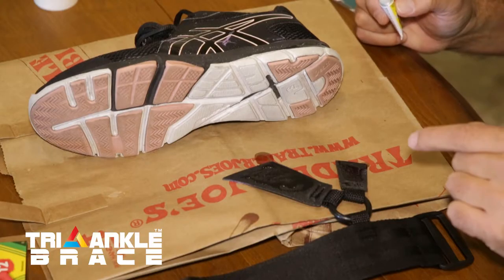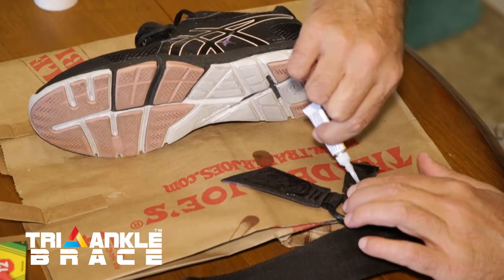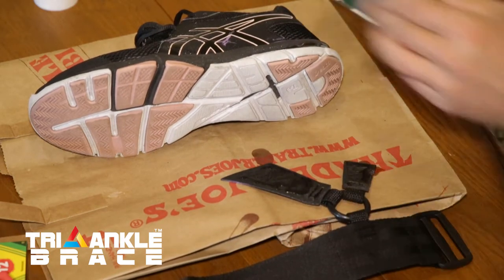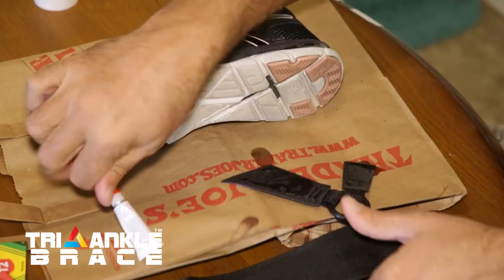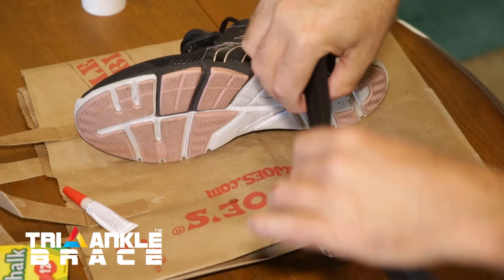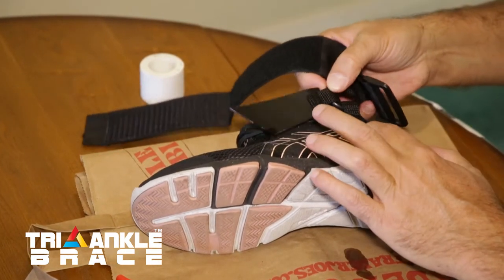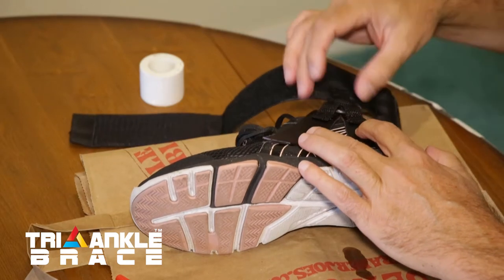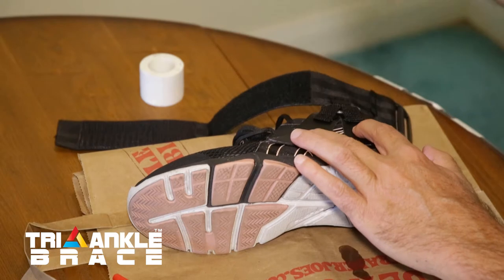Now that we have our shoes marked, we're going to put the glue on the unfinished side of the external pieces, making sure not to get any on our fingers. And then we are going to attach the brace to the shoe where we marked it. Just like that.